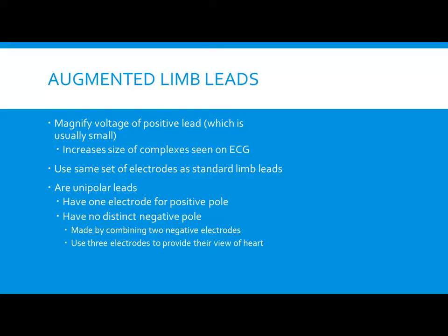All right. If we're only looking at the heart 3 ways, why do we put the right leg lead on? That's your ground. Sometimes they'll only do a 3 lead. Right, and that's what this is. That's your ground line. That gives you a ground there. We'll get more into that. But for now, just understand, because in reality, the old monitors used to just have 3 leads. But that last one incorporated is a ground.